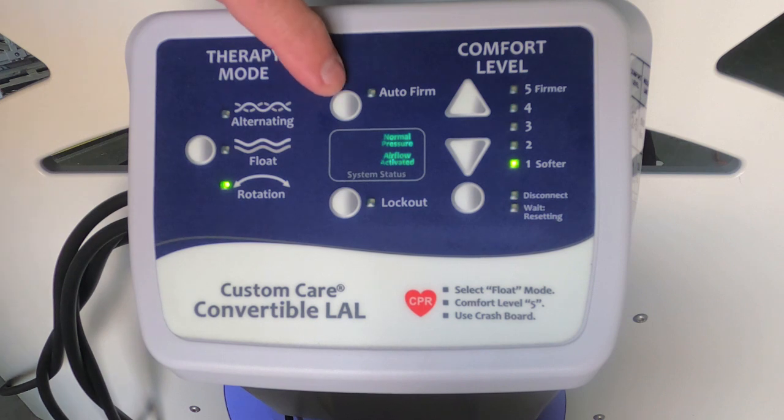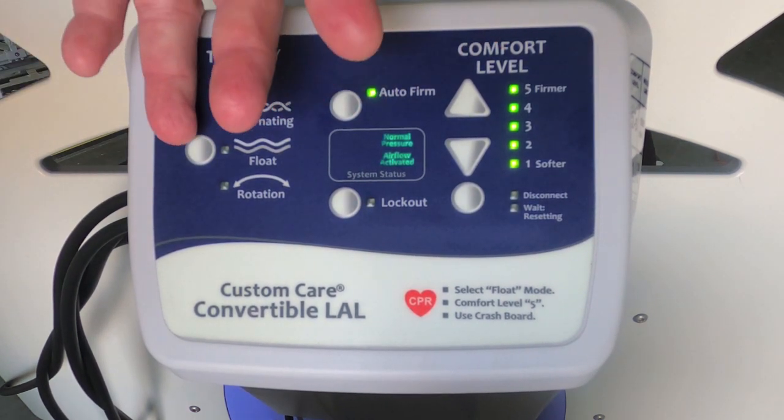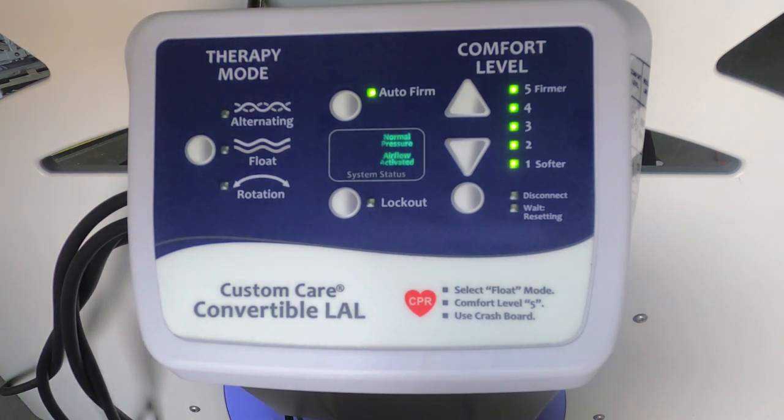You also have a button here called Auto Firm. If I press that, it overrides everything else that's going on the mattress. It brings your comfort level up to 5, so it's moving more air through the system, and it firms the mattress so that it's a nice uniform firmness of the mattress. We have the light illuminating here letting us know that that's in the auto firm mode. This is a good mode to use if you are doing a lateral transfer or a seated transfer of the patient, or just repositioning the patient. It can be helpful.